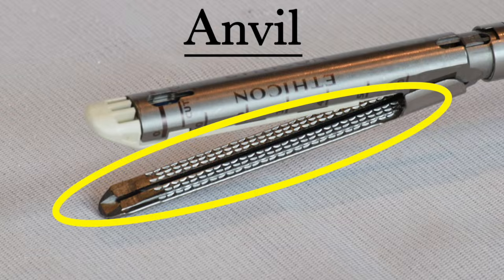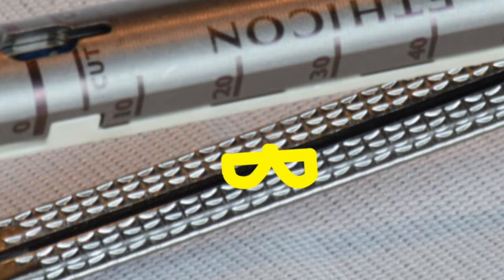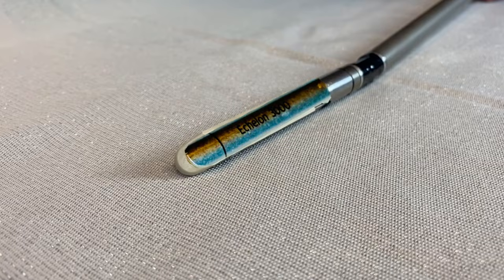Now let's flip this over so we can see the inside of this anvil. Here you can see the pockets where the staples hit, bend, form to hold that tissue. Here's an animation of what staple formation looks like. Here are some formed staples, and this is an extreme close-up. These are really small. Now, to see the stapler in action, we have to remove the anvil.